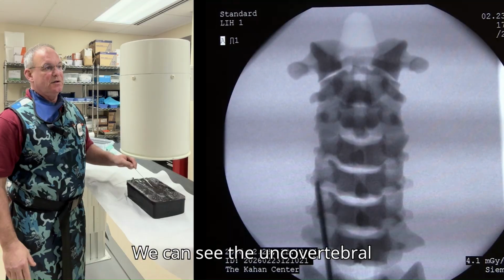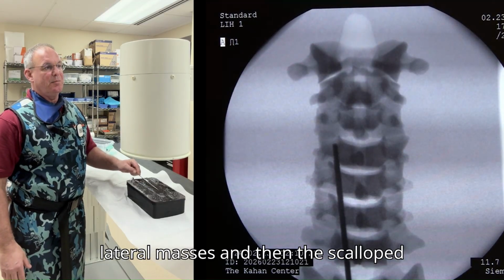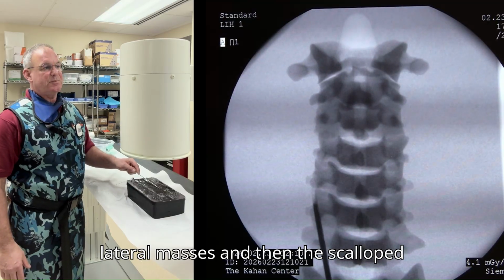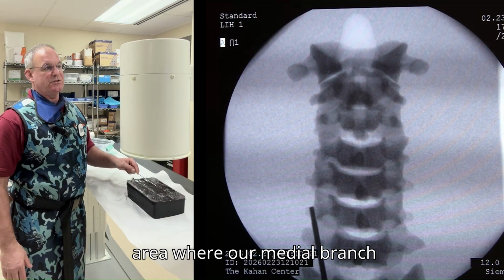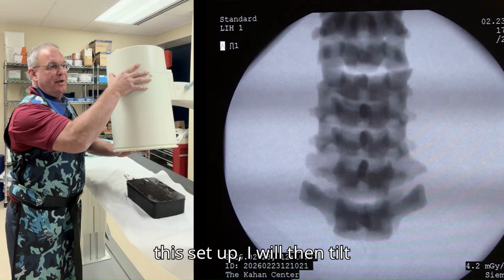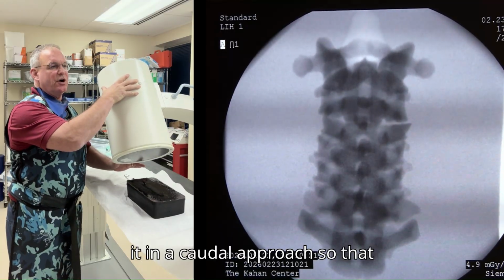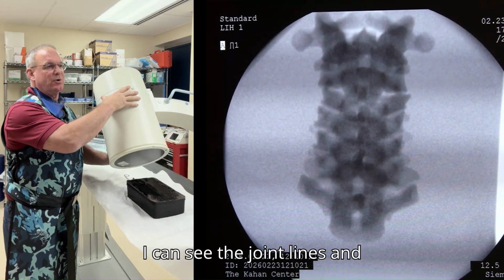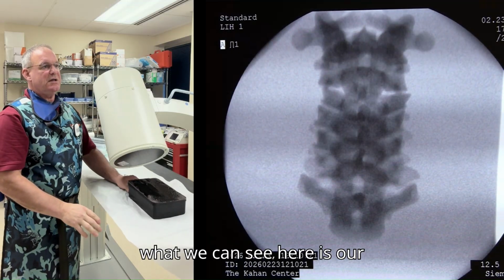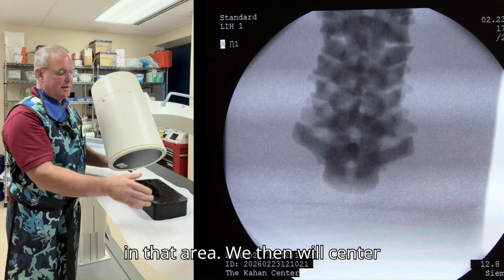We can see the uncovertebral joints, your spinous processes, your lateral masses, and then the scalloped area where our medial branch lies. Once I have this set up, I will then tilt it in a caudal approach so that I can see the joint lines.